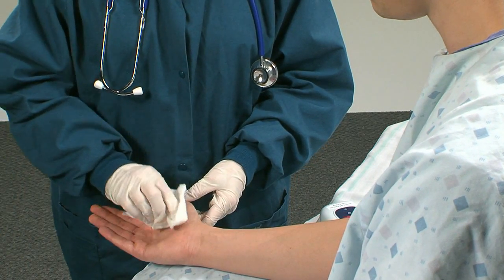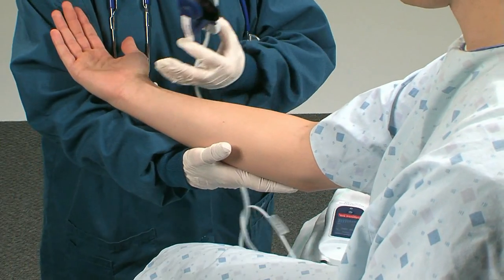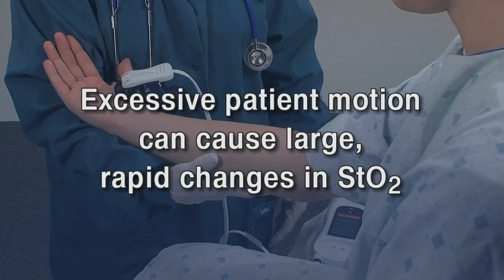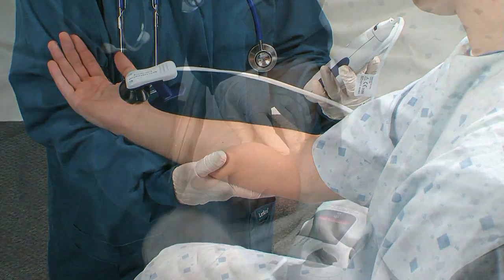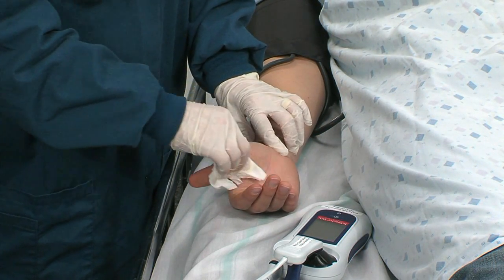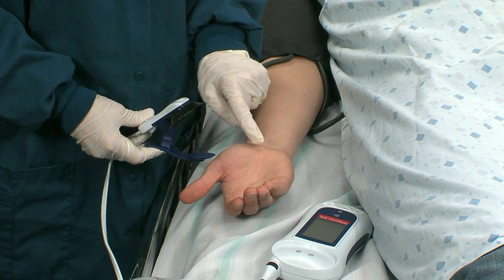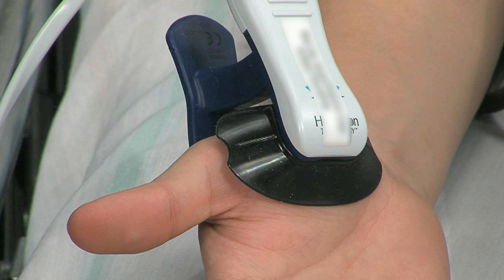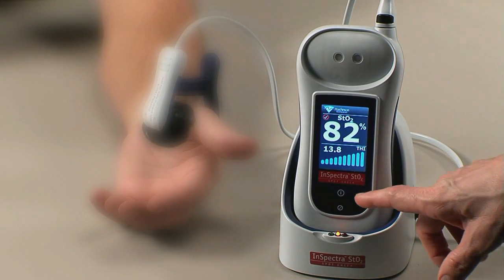Obtain STO2 and THI readings by positioning the clip over the patient's thenar eminence. The InSpectra STO2 clip is for external use only and should only be used on intact, clean, and dry skin. Note that excessive patient motion can cause large rapid changes in STO2. Rest the patient's arm at heart level with nothing restricting blood flow to the hand. Clean and dry the base of the thumb on the palmar side of the hand. To place the clip, squeeze the tabs and slide the black shield over the thenar eminence muscle, ensuring the clip is placed over the fleshy part. Ensure the clip is in close contact with the palmar side of the hand to avoid high ambient light conditions that may prevent measurement.